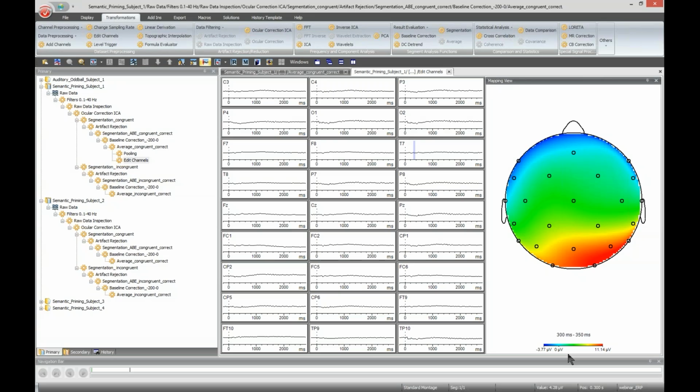You can do that in there, but you can do it in Analyzer actually, if you have markers for both the stimulus presentation and for the response. And the response marker should have been sent at the time when the button was hit, because sometimes you may send the marker at the end of the trial at a fixed time, and then of course it would not work.